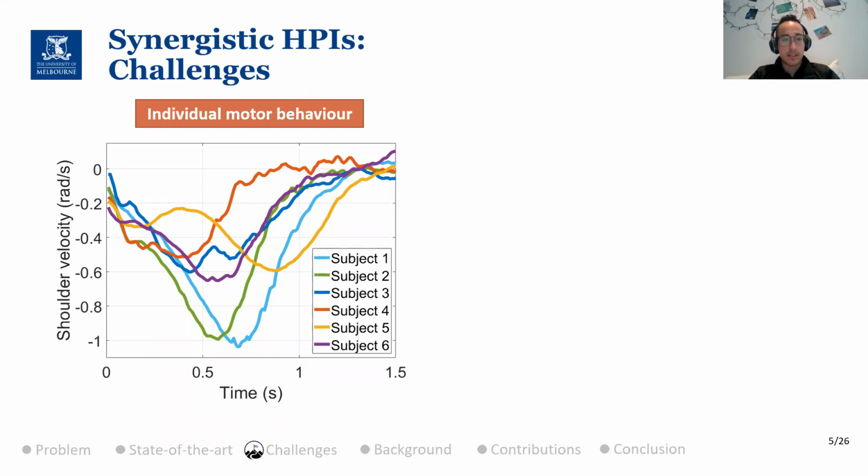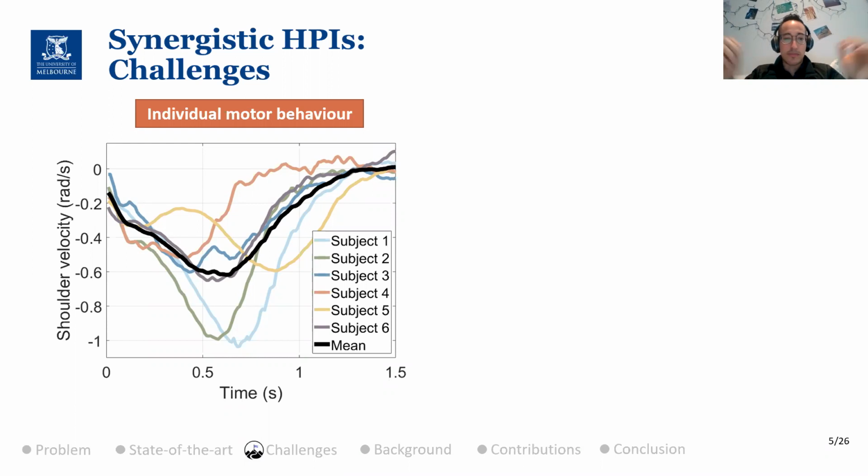In this case, the motion-based interface will be estimating: what is the elbow doing? Then they train the neural network or whatever algorithm to estimate what this elbow angle should be from all the shoulder velocities. What you would end up getting is sort of the mean out of all these, right? So you have a group of people, and the resulting estimation would be something along those lines.